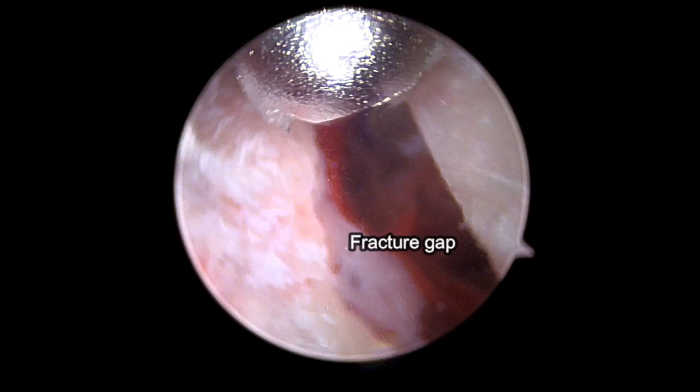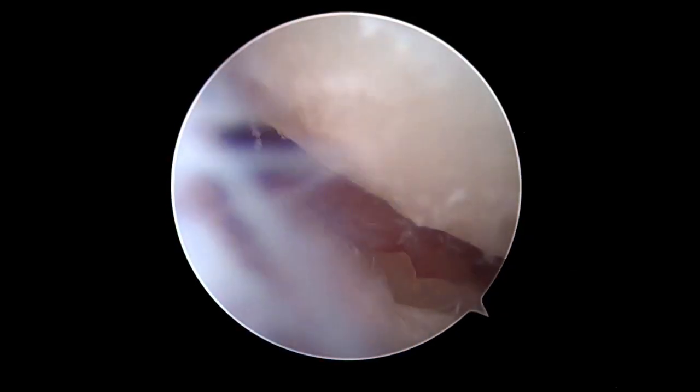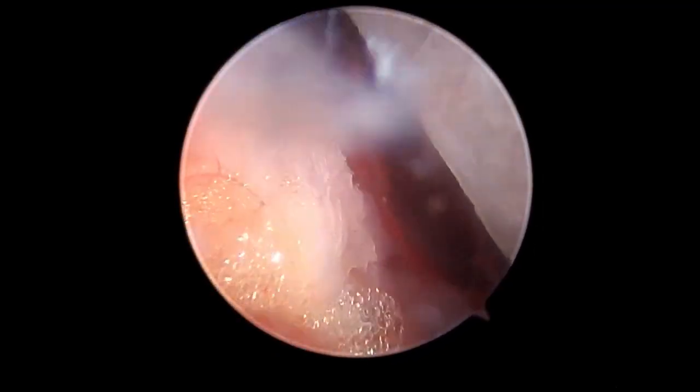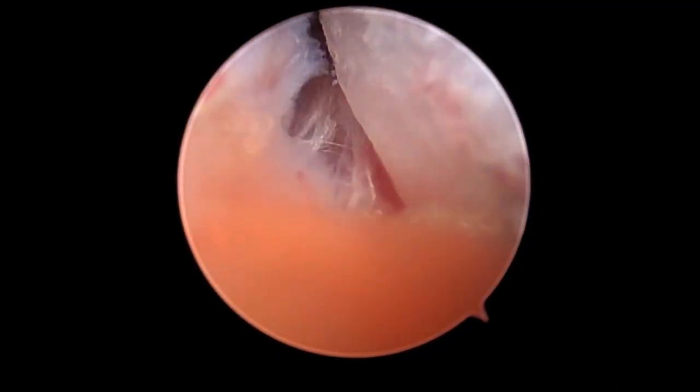Endoscopic examination of the fracture can be performed afterwards, and the fracture gap should be clearly seen under endoscopy. A percutaneous reduction clamp can be used in this case, and the reduction can be directly visualized under endoscopic view. The process is repeated until satisfactory reduction is achieved.